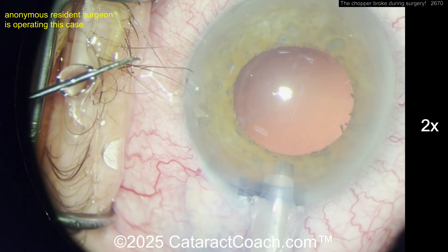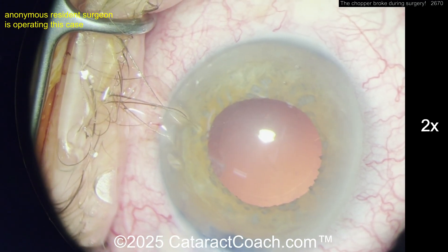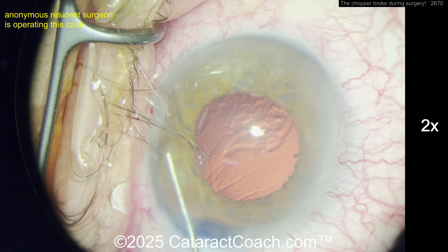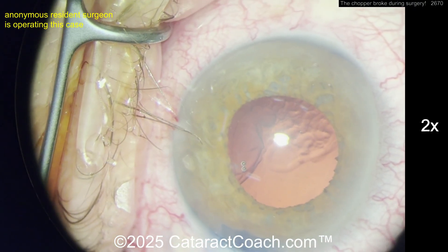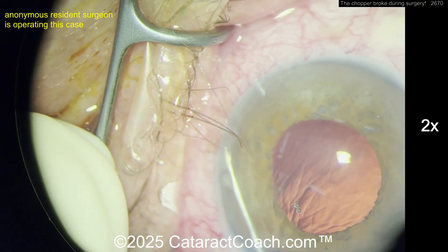There it is in the angle. You've got the chopper tip broken off in the angle. Ignore those eyelashes that have not been properly draped. What are you going to do? The first thing — viscoelastic is a smart move. I like that idea a lot. You want to kind of encase it in viscoelastic.